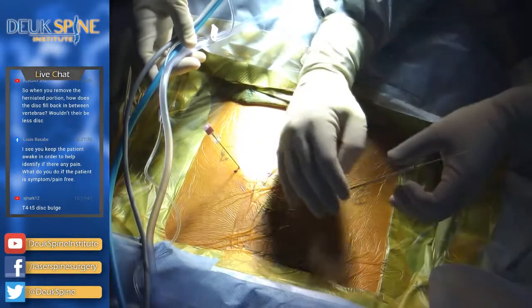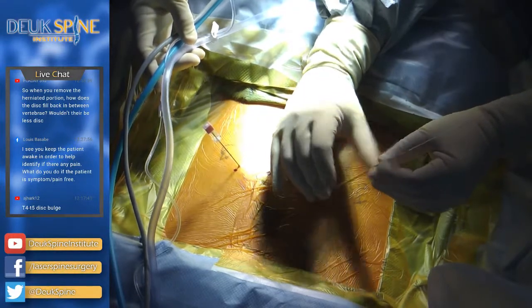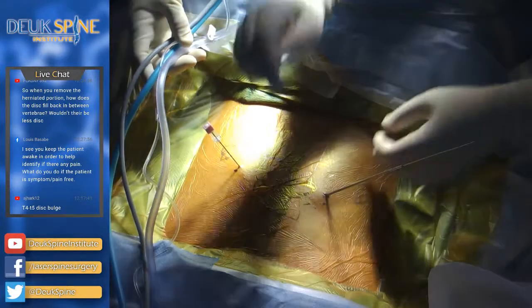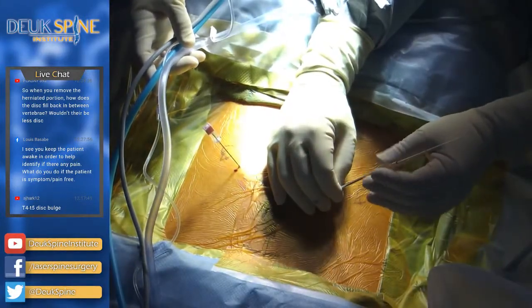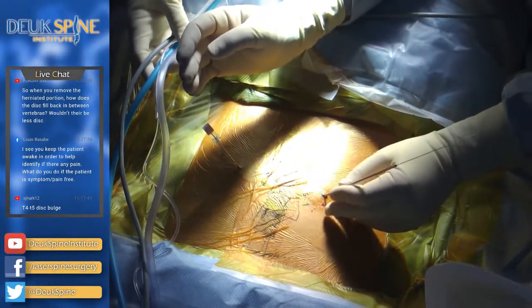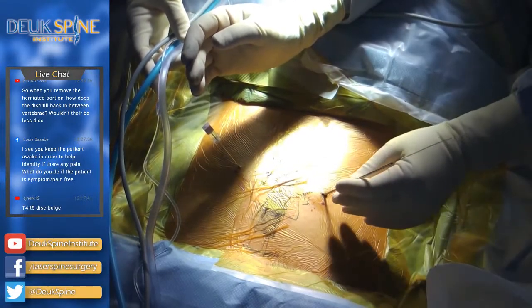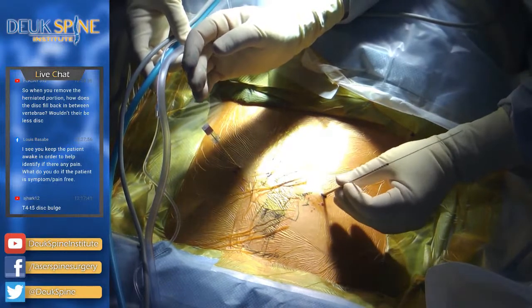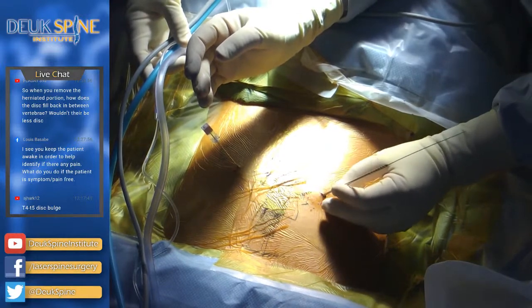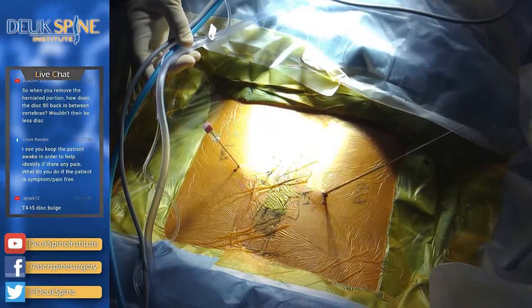Okay? So I'm going to keep getting x-rays. But I know I have a safe path because I created a safe path. That was the hard part of the surgery earlier, creating a safe path. So I've done the safe path, and now I just need to re-follow the same path I took before. And that's what I'm doing. I'm re-following that same path. Okay? And that's the magic of this surgery, is you carefully find a path that's safe, and then you just follow it over and over again until the surgery is done. And that's what I'm doing.